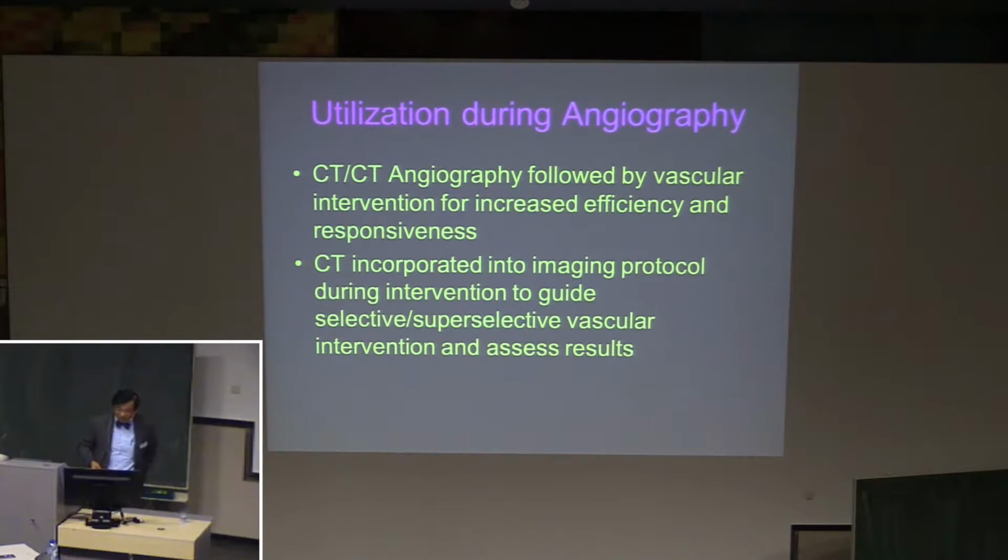I'm focusing my talk mainly on techniques during vascular procedures, typically angiography. And there are two ways that we could use it. One is to have the convenience of the equipment in the same room. So in case the patient needs pre-procedure CT or CT angiography, you can have the pre-procedure diagnostic scan done and then followed by the intervention immediately.